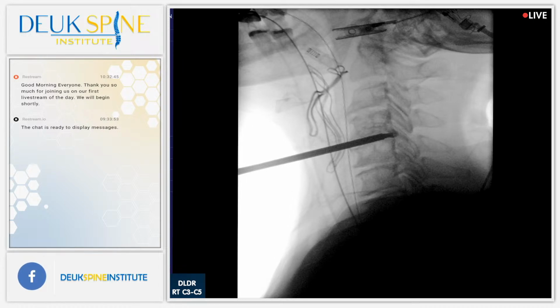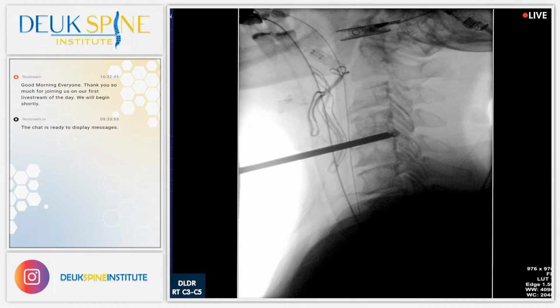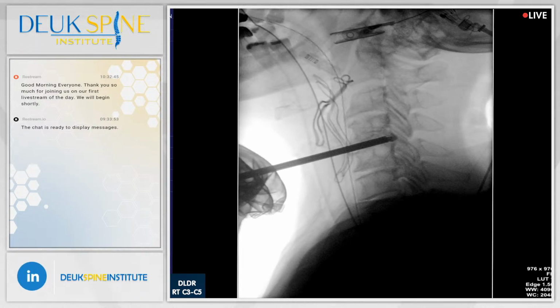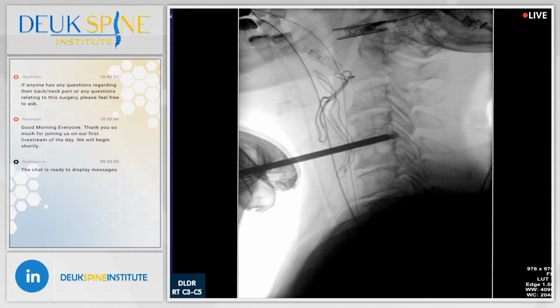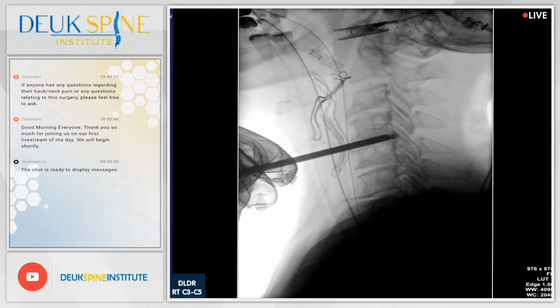Almost there, guys, a little traction. I'm gonna bring the dilator in a smidgen. Shot. Yeah, shot. And then I'm gonna take the tube right over it. Shot. All right, let's see if we can bring our tube just a millimeter more.